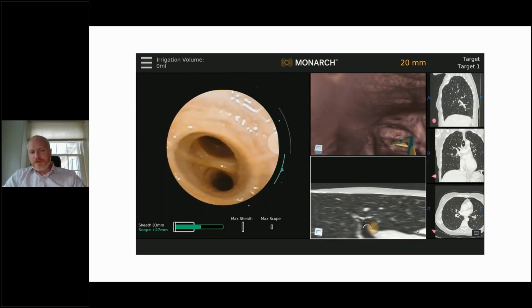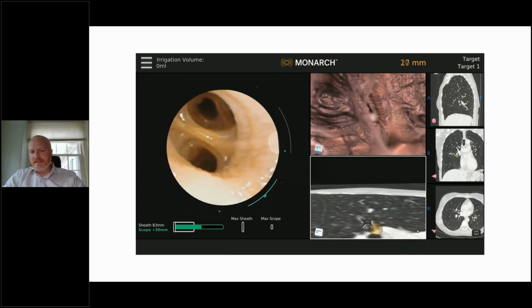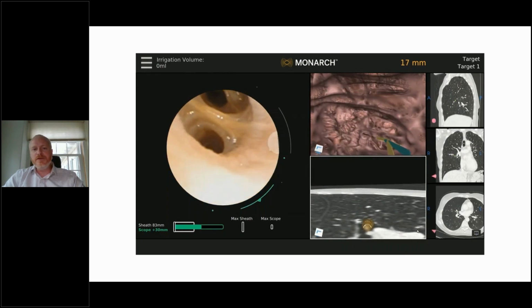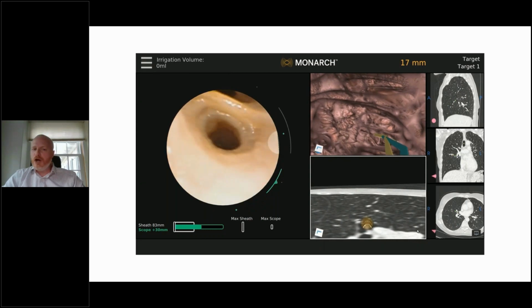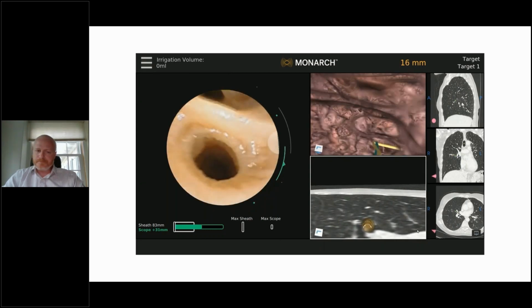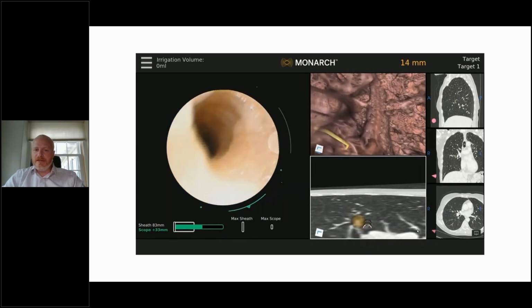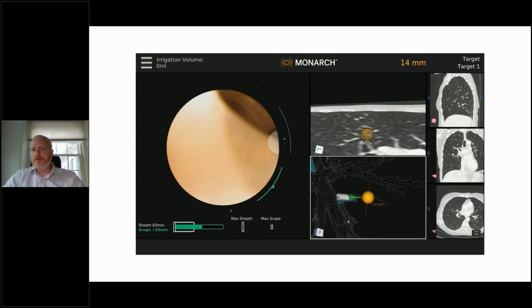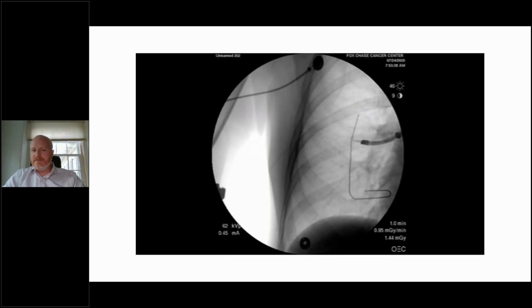In the more inferior of the two branches ahead, I know that my nodule is below the horizon. You can see in the CT overlay video, the CT overlay view at the bottom of the screen. And I'll start to target the lesion. You can see there's no endobronchial component. And so I'm going to need to get my camera and working channel in line with the airway wall and get the needle to puncture through. You see I'm 14 millimeters away from the center of an 8 or so millimeter lesion. And I should be able to biopsy it without any difficulty.